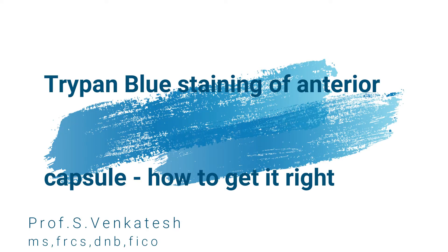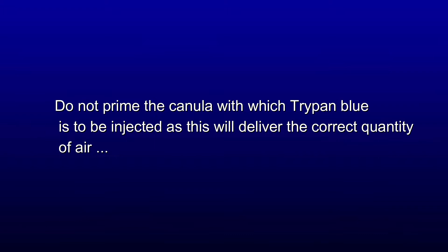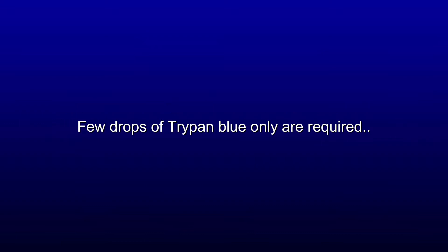Here are a few tips on how to get it right with respect to Trypan Blue staining. A small air bubble will decrease the amount of Trypan Blue required. Not priming the cannula when injecting the Trypan Blue will deliver the correct quantity of air. Remember, only a few drops of Trypan Blue are required.